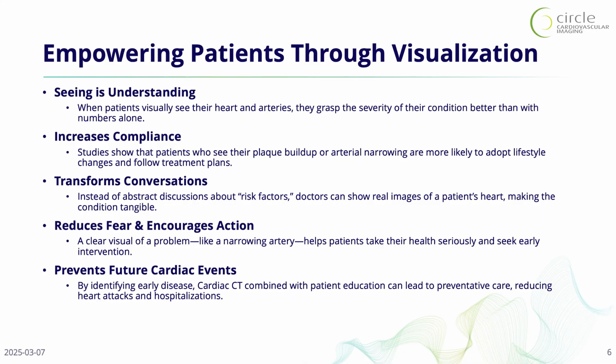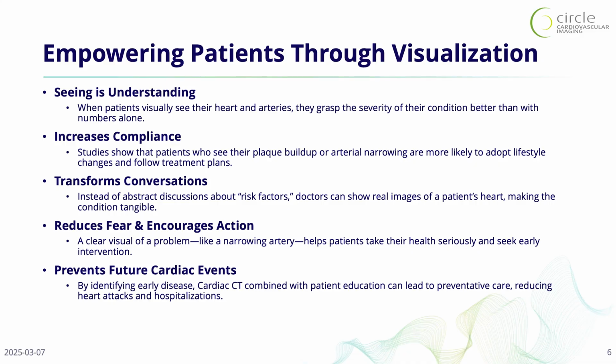So there's a really strong role for showing patients, and you yourself visualizing this. Seeing is understanding, so when patients can visualize disease, see the plaque, see the hard stuff that you're pointing out, they're more likely to be adherent to therapies, increase compliance. It can really change that conversation when they say, look, I don't want to take a statin, my best friend took a statin and now they have diabetes, or so-and-so took a statin and now they have dementia, right? There are all sorts of misconceptions out there, and you can use imaging as a tool to better convey your messaging. It definitely helps to reduce fear and encourages action because they're directly visualizing disease. It gives them a sense of control.